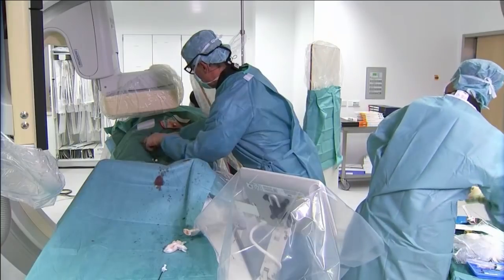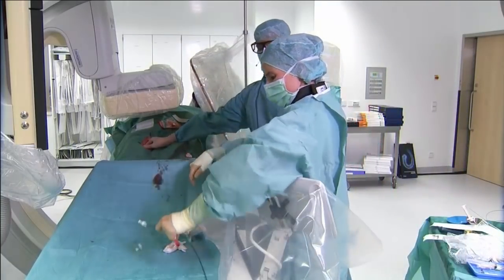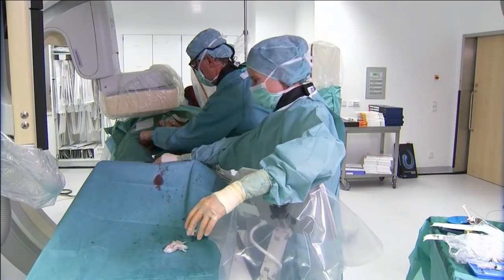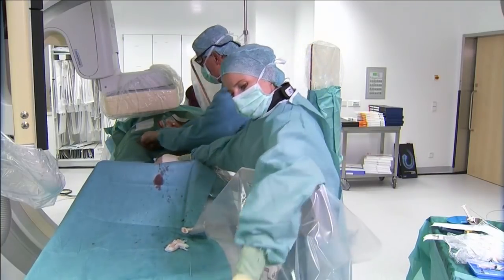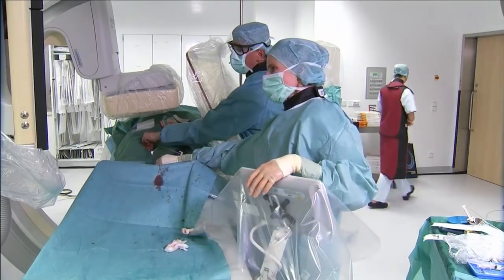Everything okay? Andrej, what sheath are you using here now? What centimeter? 25? Yeah. 55. Hopefully this is not too long. 55, for the Brockenbrough needle. Can we have the Brockenbrough needle?